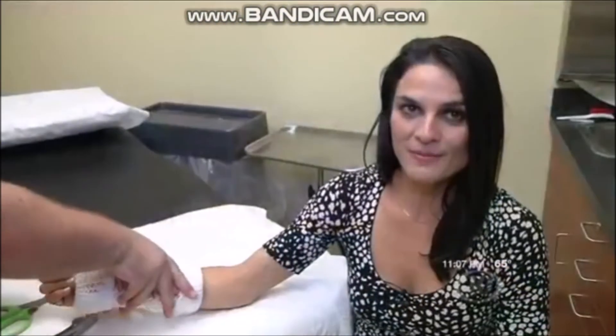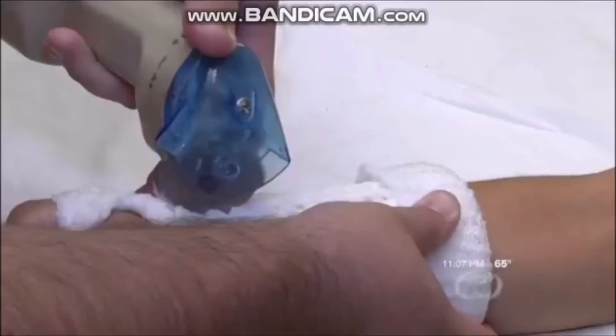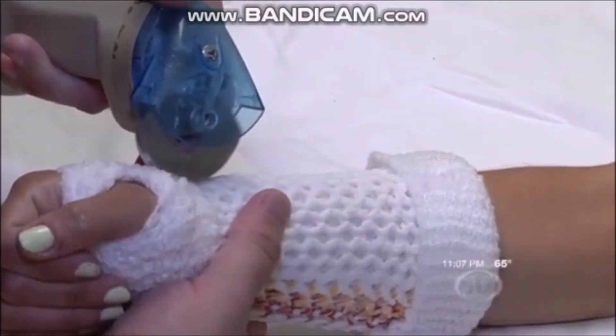Dr. Rosensweig's office in New Iberia is one of three locations in Louisiana where you can get the Osteofix cast. Osteofix says that since the cast is waterproof, it doesn't damage easily and doesn't need to be replaced like other casts would.